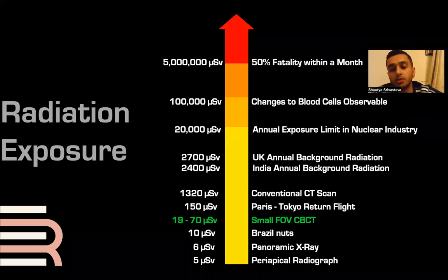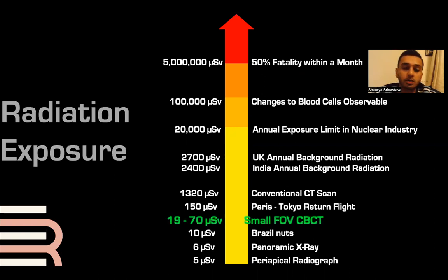It really depends on which machine you use. Not the 70 is the end of the world. But you can see that, right? This is where we are. This is how low we are when it comes to exposure on radiation.